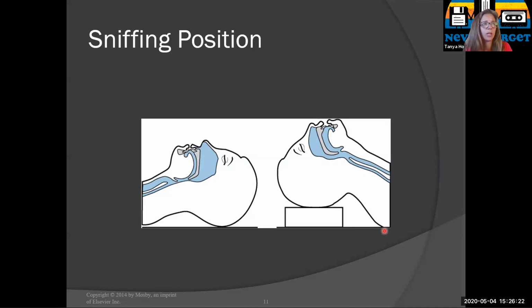I've seen people, instead of putting a towel or whatever under their head, put it under their shoulders, and perhaps by lifting this part of the body up, you can still see okay. Again, my thing is whatever you can do to keep the patient in the optimal position, the easier the intubation. You want to intubate on the first time, and you don't want it to be three or four times later. And that whole time the patient's airway isn't established, they're desaturating, it's stressful. So anything you can do to make it the best case scenario, that's the best thing to do.